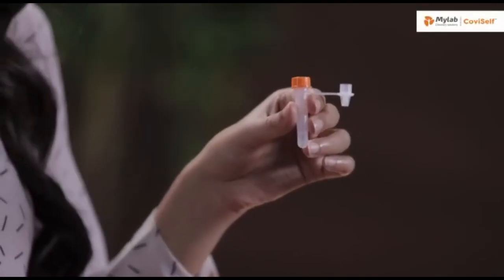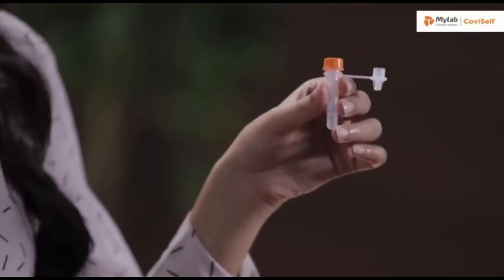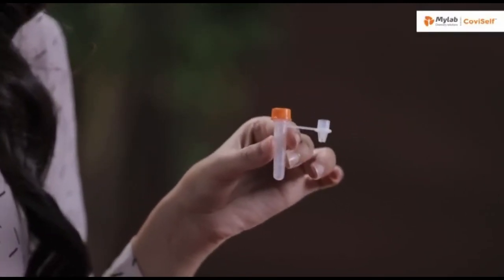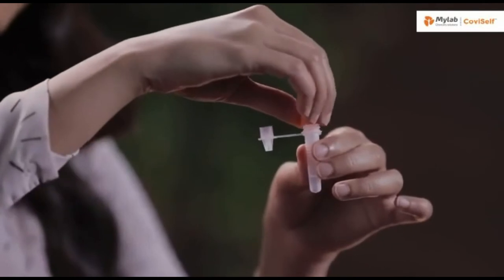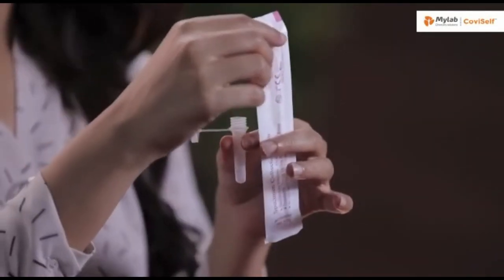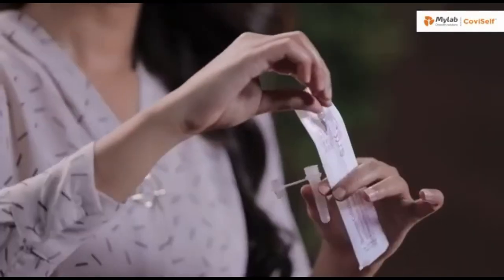Let's begin with the test. Take the pre-filled extraction tube and tap it gently three or four times to ensure that the liquid settles at the bottom. Unscrew the cap and hold the tube in your hand. Open the sterile nasal swab while holding the tube in your hand. Tear it from the tail end.